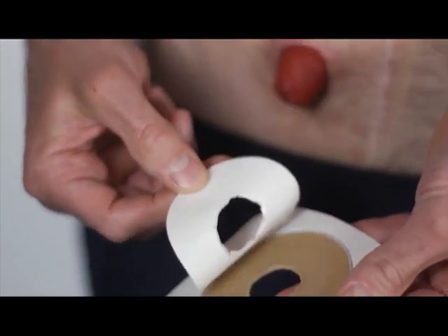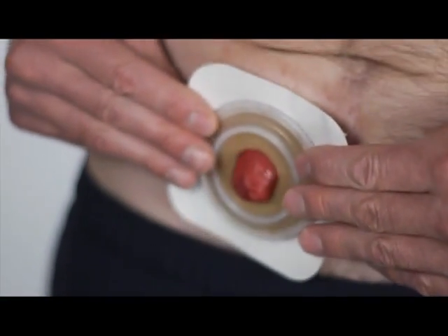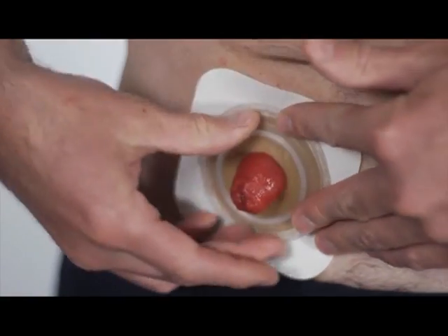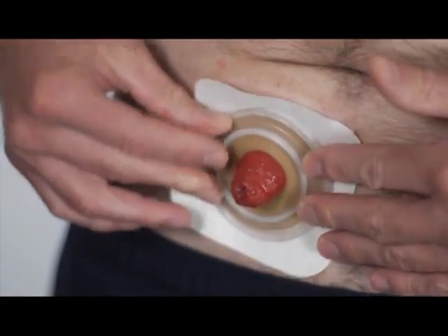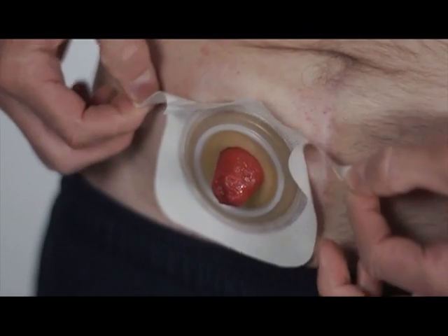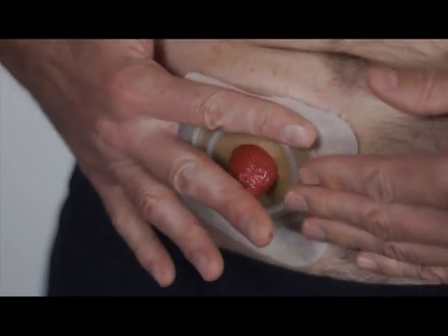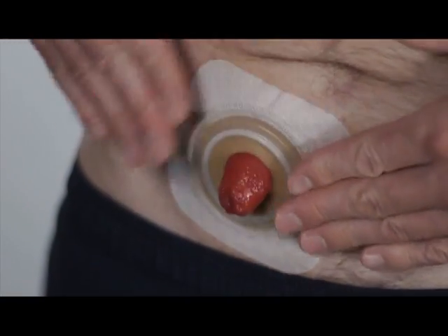To apply the wafer to your skin, remove the release liner from the back of the wafer. Do not remove the release liner from the tape, and center the opening over your stoma. Hold the wafer onto your skin with the palm of your hand for 30 seconds. The body heat from your hands helps the wafer stick to your skin. Peel the white release liner from the tape border and press gently against your skin, smoothing out any wrinkles.